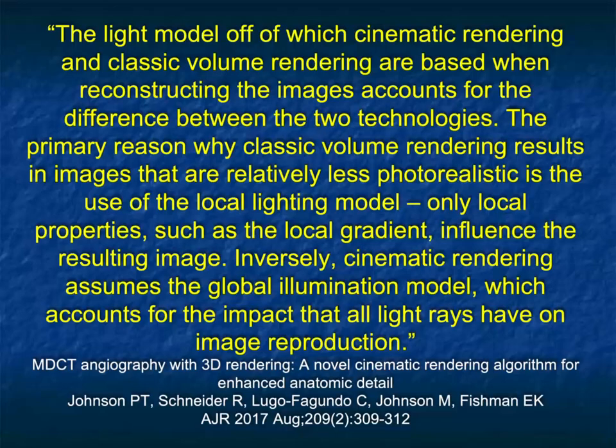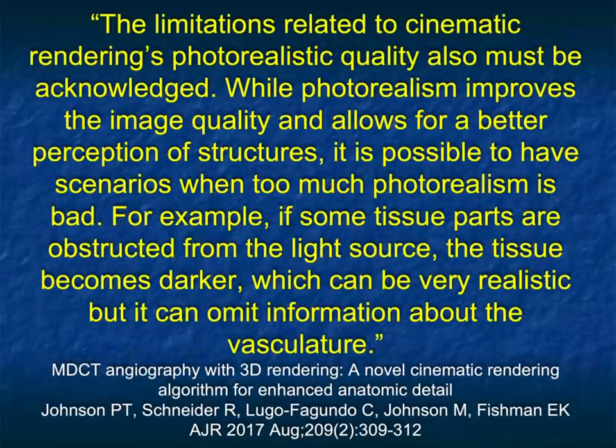It's all the lighting model. And again, cinematic rendering assumes the global illumination model, which accounts for the impact that all light rays have on image reproduction. Again, these multiple light sources are one of the key concepts hiding within cinematic rendering.